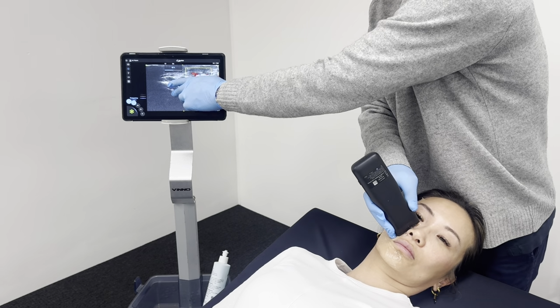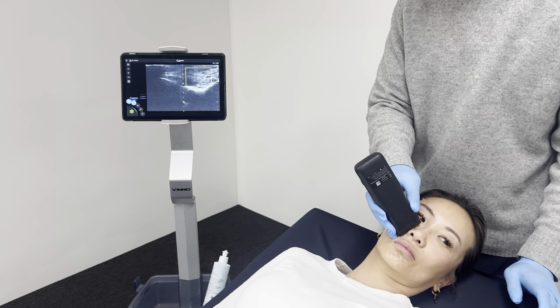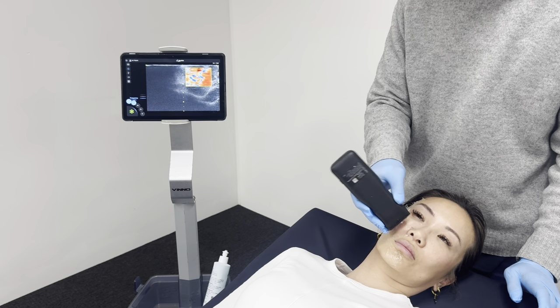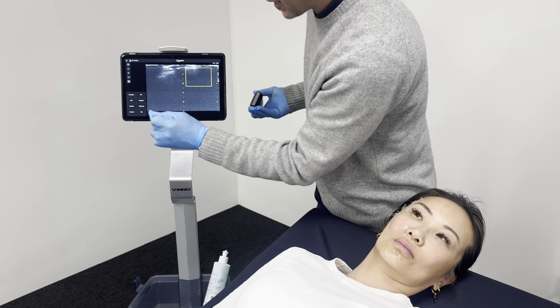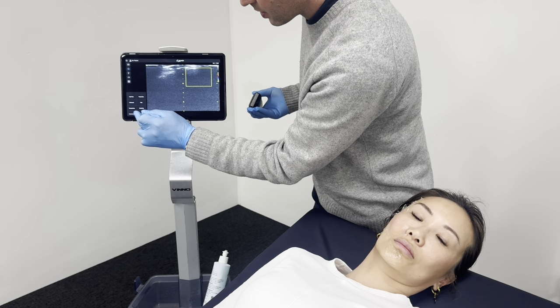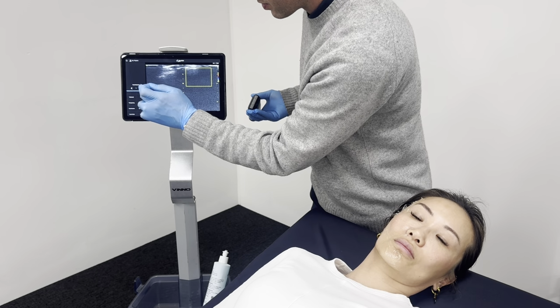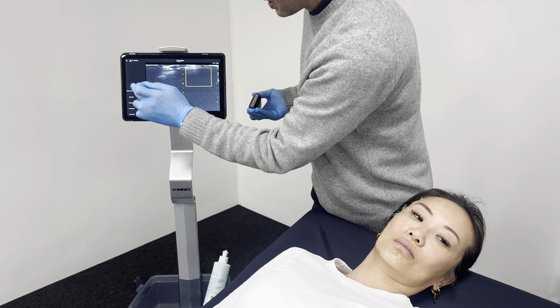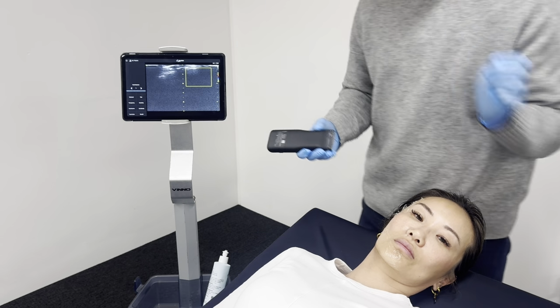Again, I'll just turn down the colour gain so there's not too much noise. The other thing you can do if you're getting a lot of noise like I am at the moment is you can actually go into the colour settings in here, and you can turn on flash reduction. So there's an option here that says flash reduction. You can find it there, and I'm just going to turn that up to the max, and that should help us to get rid of some of that noise that we're getting.